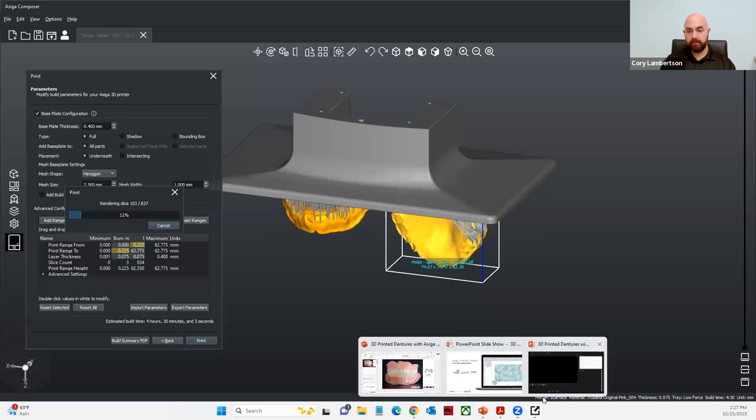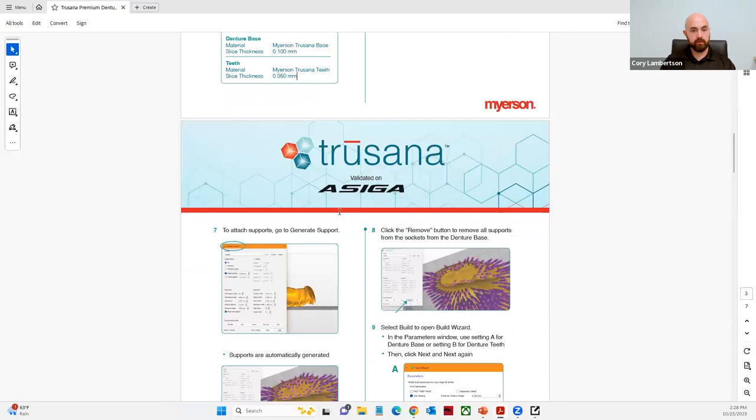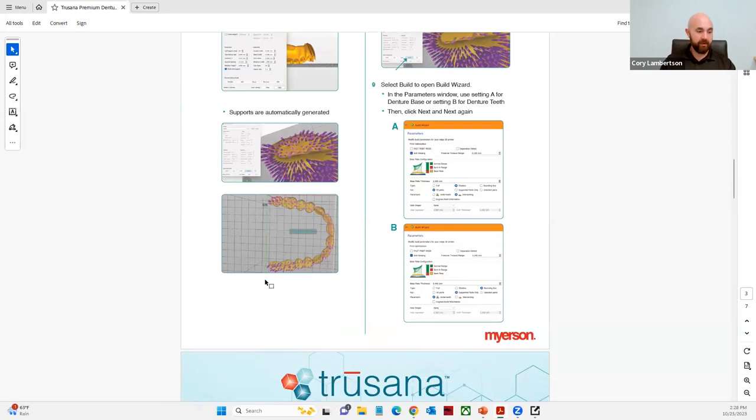While we're waiting for that to load, let's go ahead and start nesting the teeth material. For the denture teeth, we need to print at 50-micron layers. We're going to generate the supports and apply them to the occlusal surface. The nice thing about the denture teeth is that there's really not much editing you have to do, so we'll leave that as is.